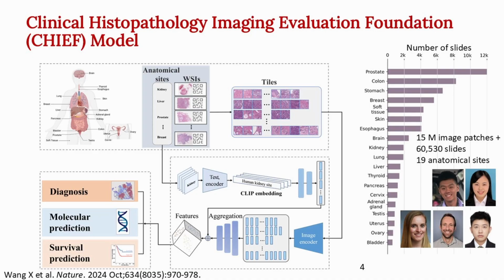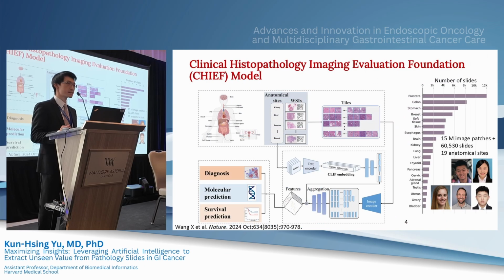And we've also been able to predict some previously unknown clinical insights, including their survival outcomes and the treatment response, using the standard H&E pathology slide. And this system is a foundation model. So first of all, what is a foundation model? A foundation model is a large model trained with large and diverse data sets.